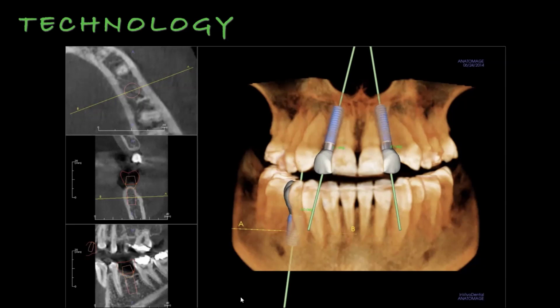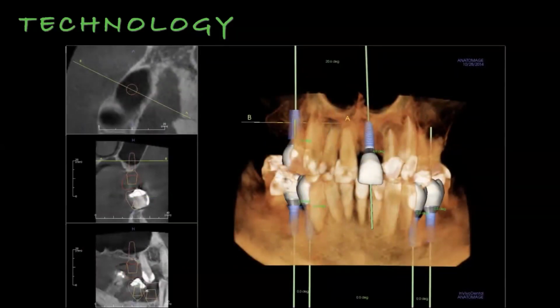And then after that, we can add bone if we need to in the future, but the patient knows that, and it's not a before and after photo of someone else's mouth. It's their mouth. It's instantaneous. It's one software. And the beauty of this is it helps you practice. Now, when I'm doing something, I already know what size of implant I'm placing, where I'm placing it, how many I'm placing, and if I've got a graft or not. It allows us to provide an estimate to the patient that's very accurate at the very beginning and really allows us to be a flat fee office. And so little by little, every single case, the more we plan, we see something going up into the sinus, we tell the patient, you see this black area, this is your sinus, there's no bone in that area.